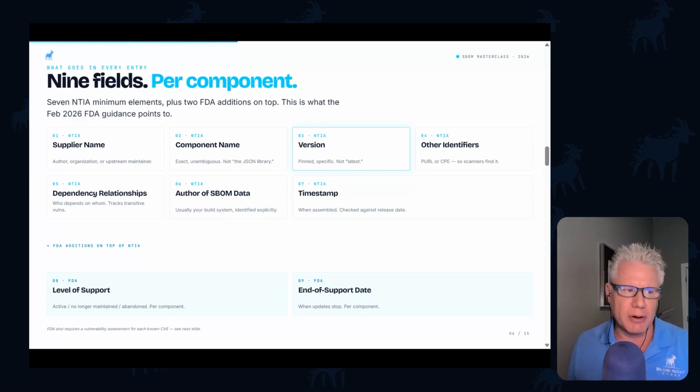And this is a very important thing to consider. When you're submitting an SBOM, it has to be your latest version of the software and timestamp, because a vulnerability today may change from low risk to high risk if a new exploit comes out for it. Or a component that has no vulnerability today, somebody may discover a vulnerability with it tomorrow. So the timestamp is super critical.